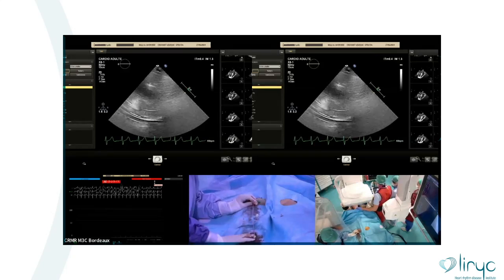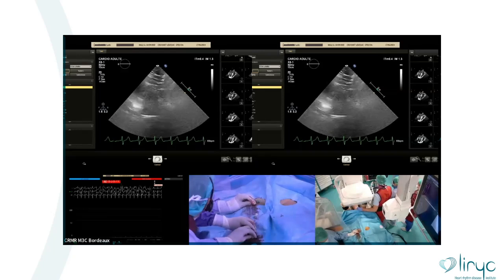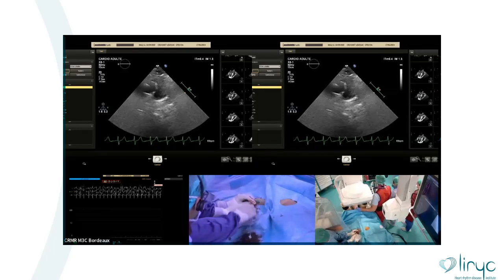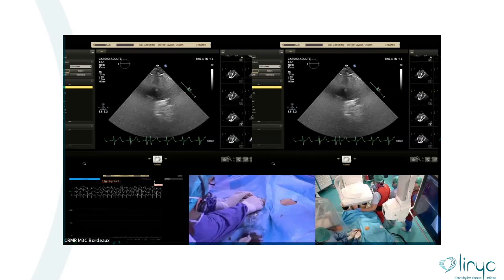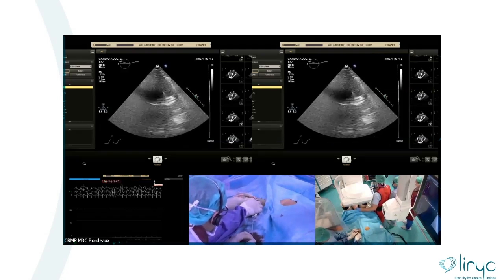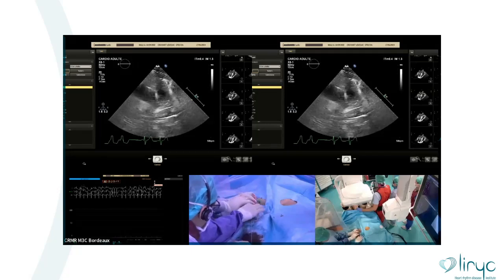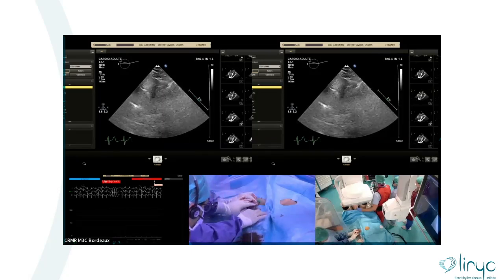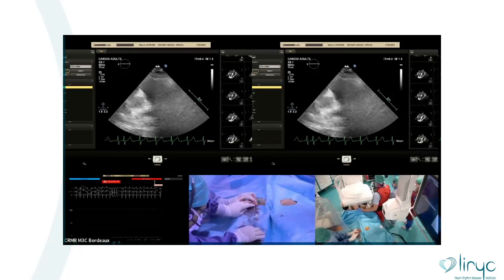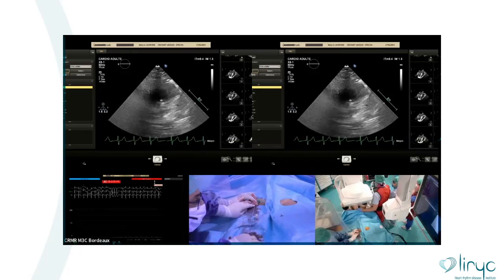Pull back the catheter and hold the wire. And wait a minute, we should mark how deep we have inserted. Okay, you pull the catheter out, hold the wire. Okay, good. So we mark again how deep we have inserted the pigtail. So we know how deep we should insert the delivery system.